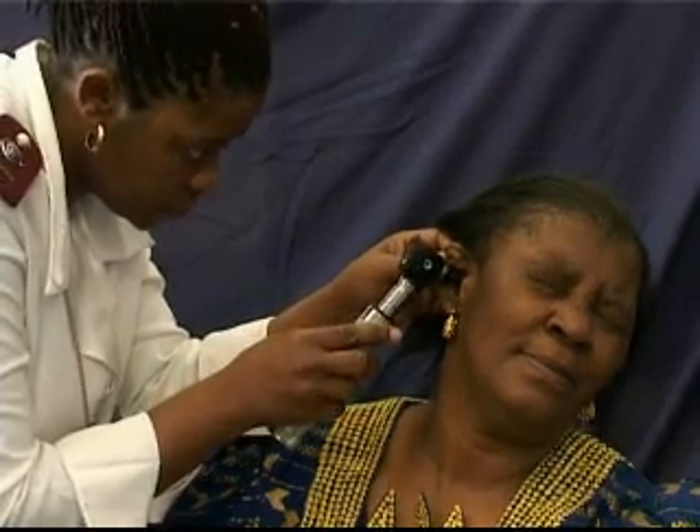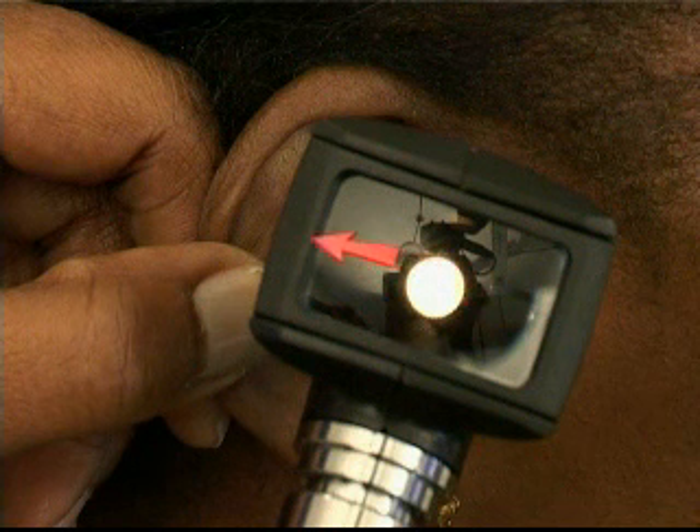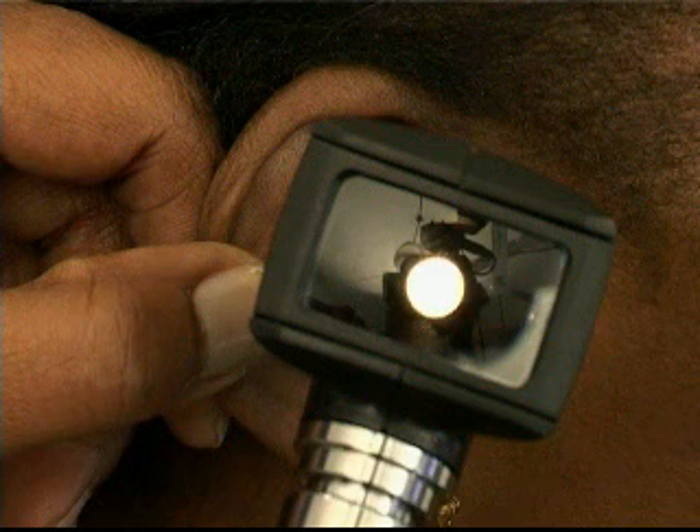To visualize the tympanic membrane and ear canal. Should you wish to insert a probe or similar instrument through the otoscope, the magnifying window can be slid open, the probe or small forceps used, then withdrawn and the otoscope removed gently.